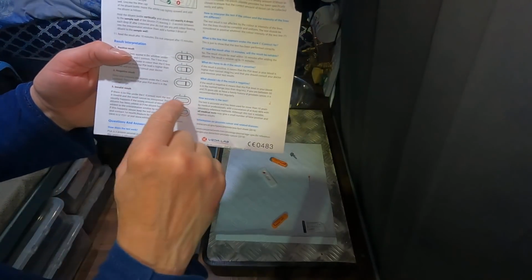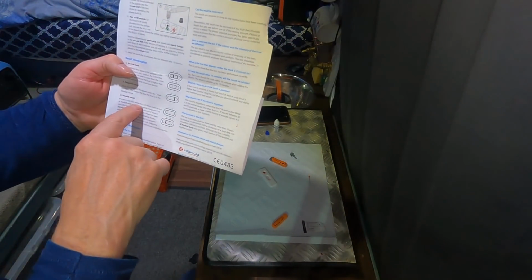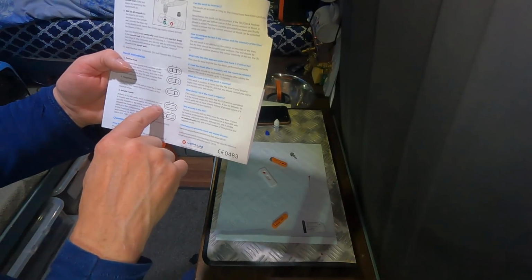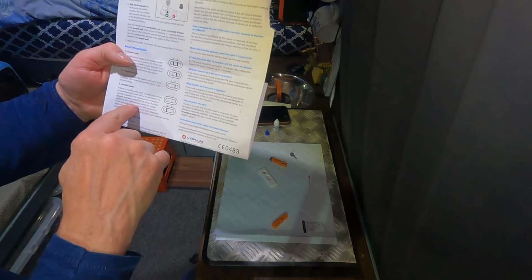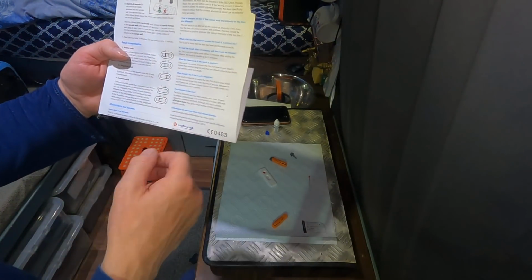This line says only 1 coloured line appears under the C mark control. This means that your PSA level is in the normal range. Invalid result would be nothing. What's that meaning? If there is no line under the C control mark, the test is invalid and the result cannot be interpreted. This usually happens if the wrong amount of blood or diluent has been added, or if the diluent has been added to the interpretation window by mistake. If this happens, please keep the test components and contact us.